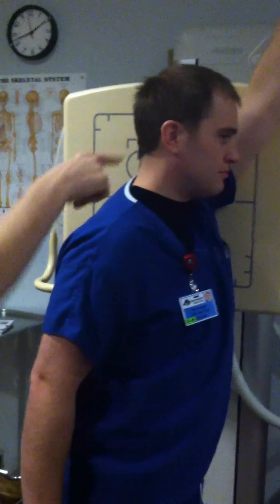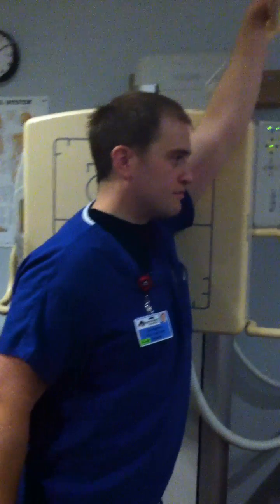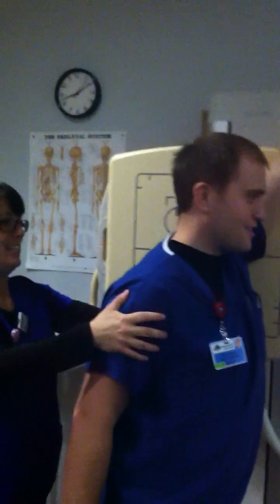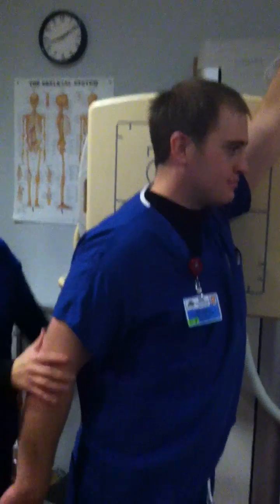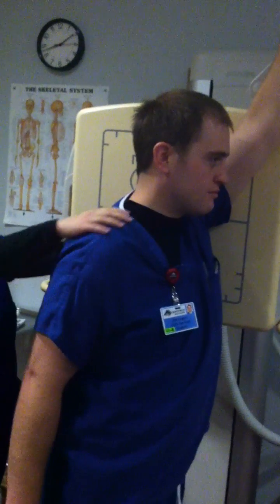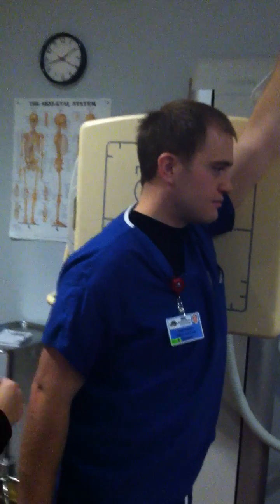Look at how he's facing too — he's facing that wall over there. We need to remind him to face straight ahead. Kurt, are you moving? This is a very uncomfortable position. I know, I can't imagine. And not too far back because then it's going to bring it up, so just kind of... yeah, that and the ladder.